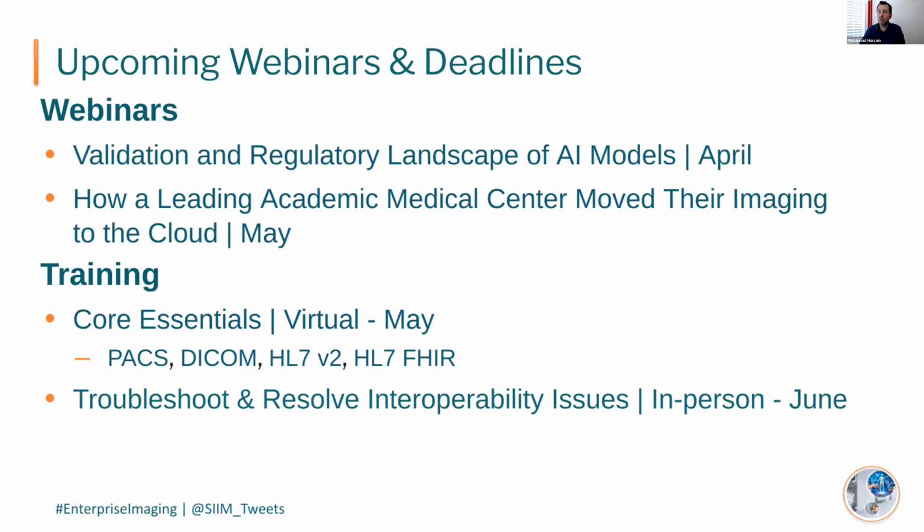I'm going to start with a question that came in about the importance of community engagement. So maybe each one of you can very quickly comment, like 30 seconds or so, starting with you, Ali Reza. What's the importance of community engagement in your project? And what are calls for action you can provide to people on today's call for things they can do to contribute, not just use this project?